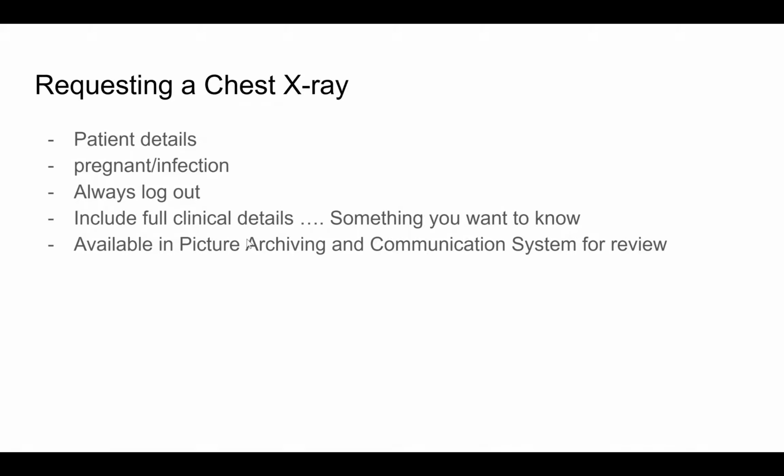Whenever a chest x-ray or any imaging is requested, it is available to review for the clinician as well as for the radiologist in PACS. PACS is the Picture Archiving and Communication System. These electronic requests are queued in the work list for the radiologist and the radiographer, and then the patient is called in order of urgency.